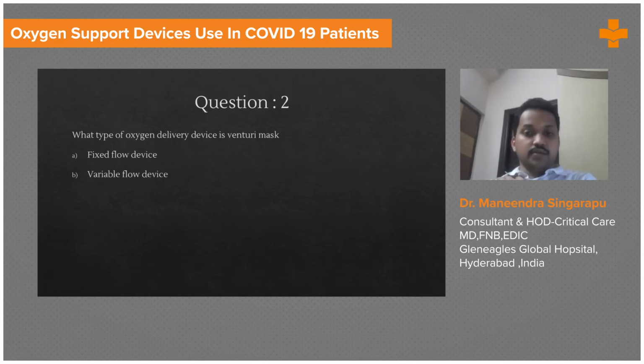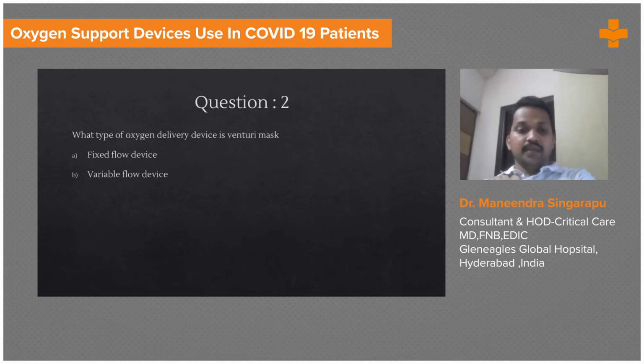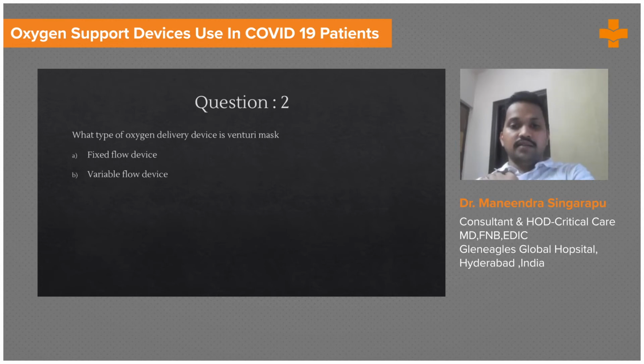So this is my next question. What type of oxygen delivery device is a Venturi mask? So Venturi mask is a fixed flow device. So what is fixed flow device? Oh, someone has answered well, Dr. Divya. So absolutely correct, Divya. It is a fixed performance device.